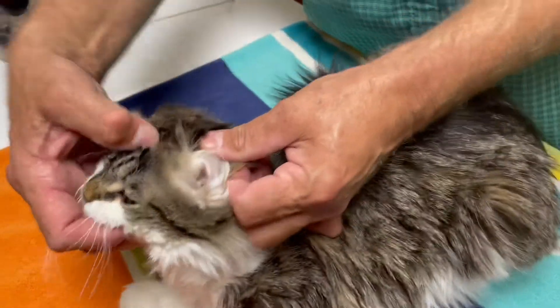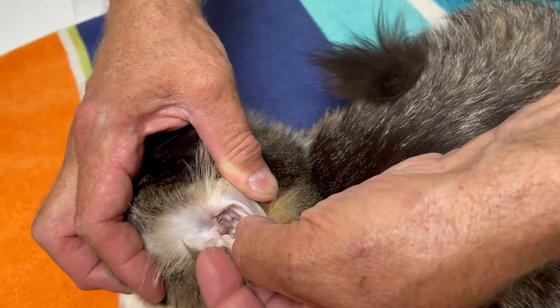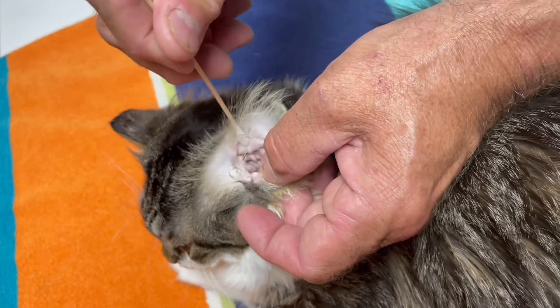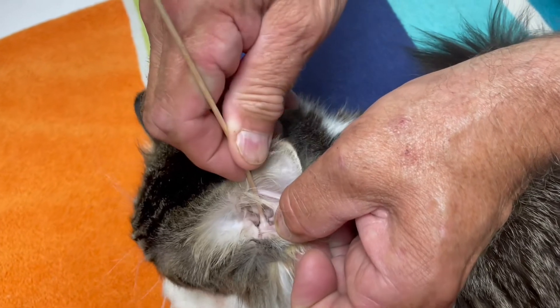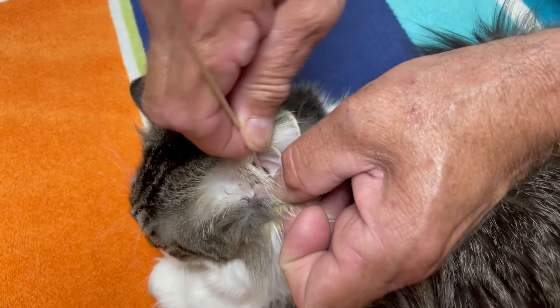We're again going to demonstrate on Junior's other ear. Dr. Molitor is again opening the ear very gently to expose that ear canal. We're going to take that q-tip and gently rub it back and forth — always keep that q-tip visible, and that's how you ensure you're not going too deep into the ear canal.